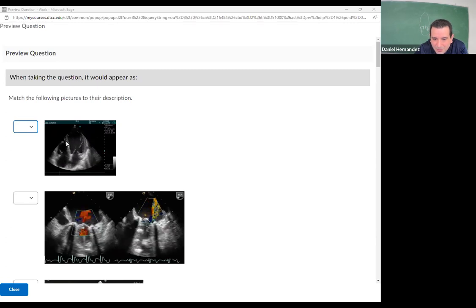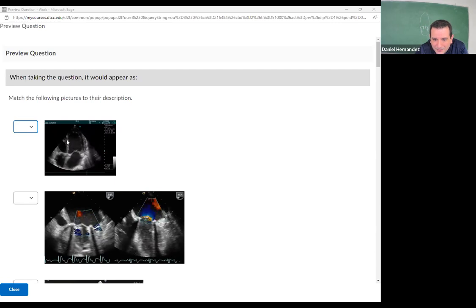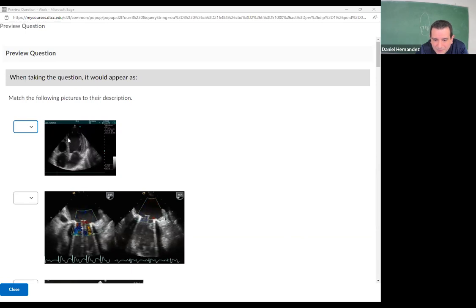You guys remember which coronary artery that would be? So it's probably 2. This basal portion of it is typically the right coronary artery. And then when you get more into this mid segment, that becomes LAD. So LAD going into the apex. So maybe right, and then maybe also LAD as well.